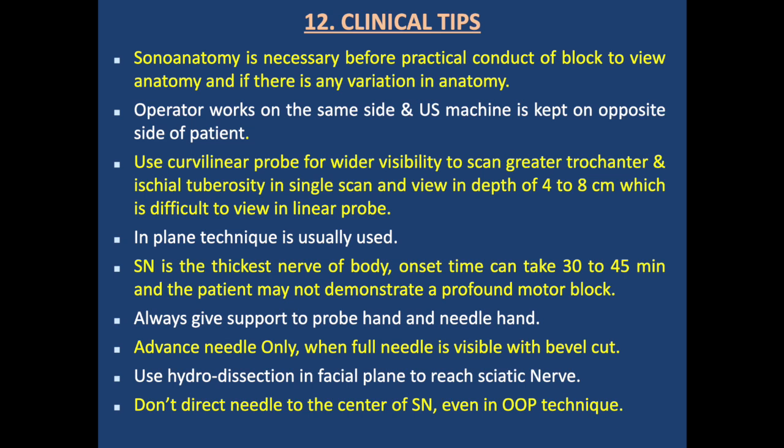In-plane technique is usually used. Out of plane may be used. The sciatic nerve is the thickest nerve of the body, and set time can take 30 to 45 minutes, and the patient may not demonstrate a profound motor block. Always give support to the probe hand and the needle hand. Advance the needle only when the full needle is visible with bevel cut.